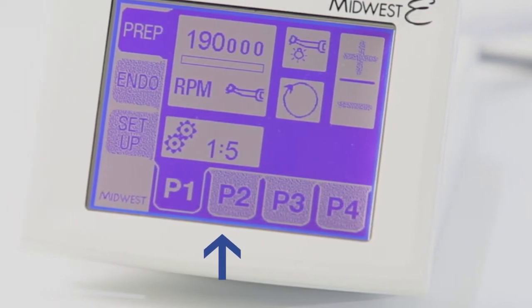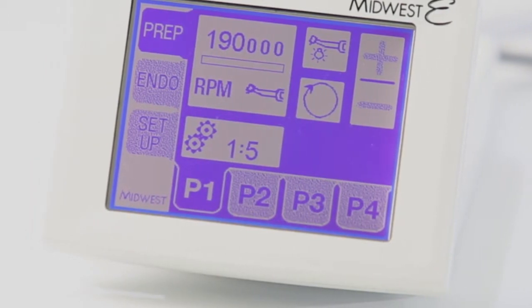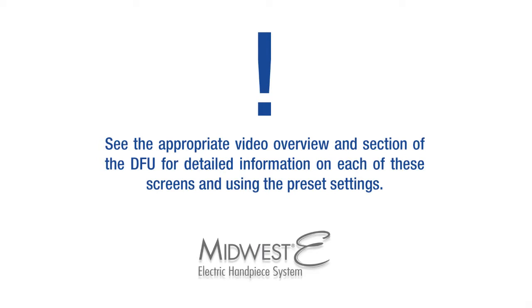These eight presets allow you to more quickly access your most common operating parameters. See the appropriate video overview and section of the DFU for detailed information on each of these screens and using the preset settings.